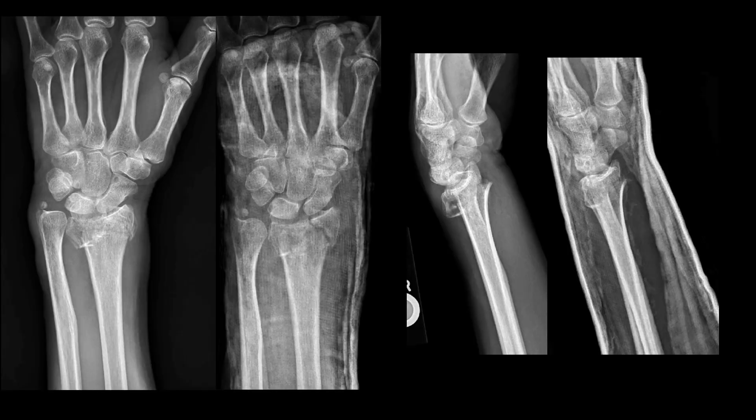Here are the post reduction x-rays performed after a splint had been applied. While this reduction is not perfect, it is adequate to the degree that the patient had significant improvement in pain and could be discharged with orthopedic follow-up for outpatient surgical correction of the intra-articular fracture. In this patient's case, utilization of ultrasound allowed the reduction to be performed without having to coordinate with x-ray, and with assurance that the reduction was performed to a sufficient quality so as to avoid having to go back to the room, take down the splint, redose analgesics, and start over with the manipulation.